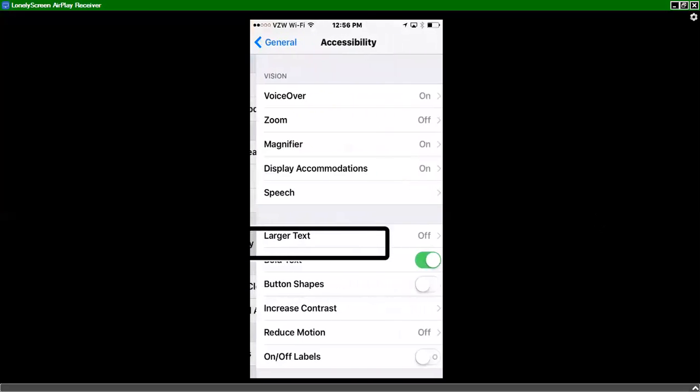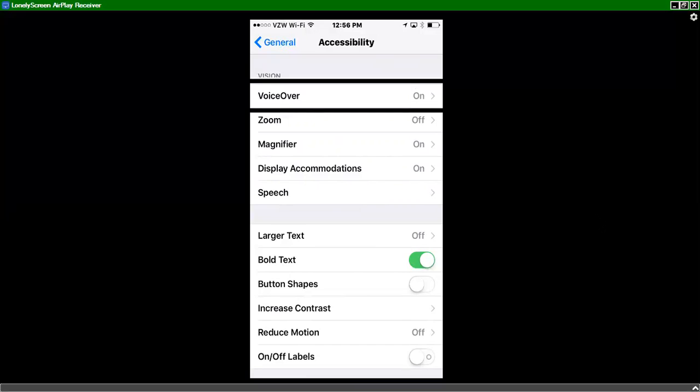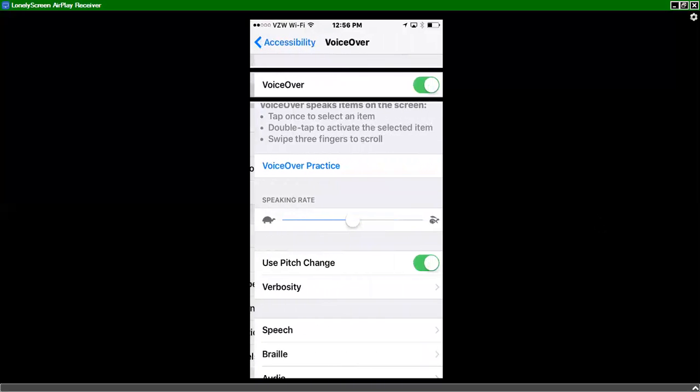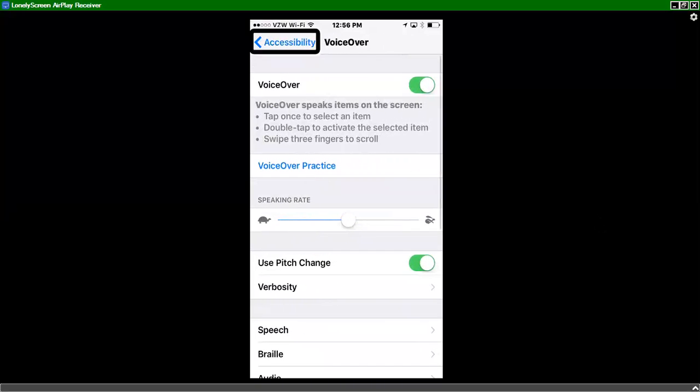Select. Accessibility. And we'll choose voiceover, which I know is right at the top. Voiceover. On. Button. I'll double tap there. Voiceover. Voiceover.